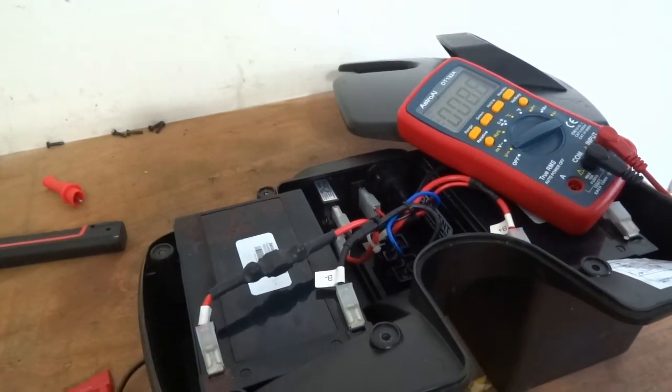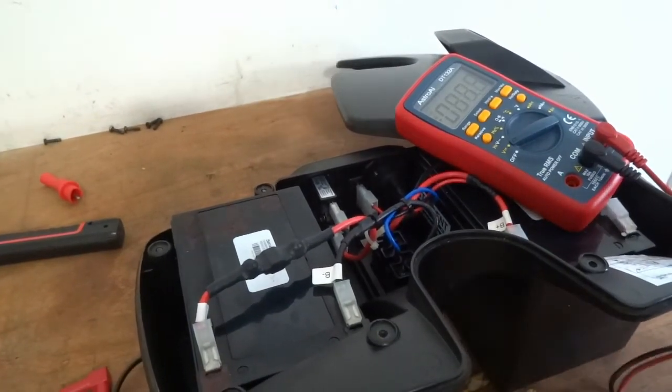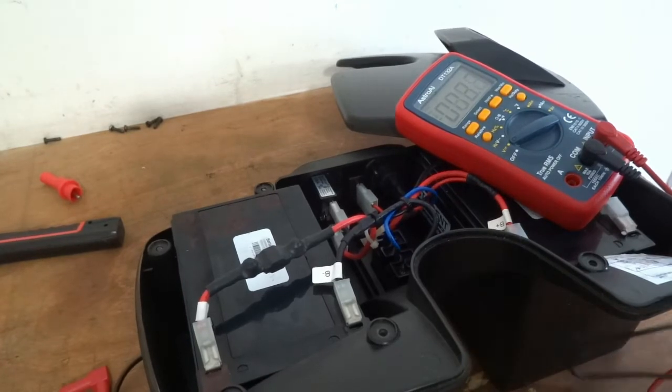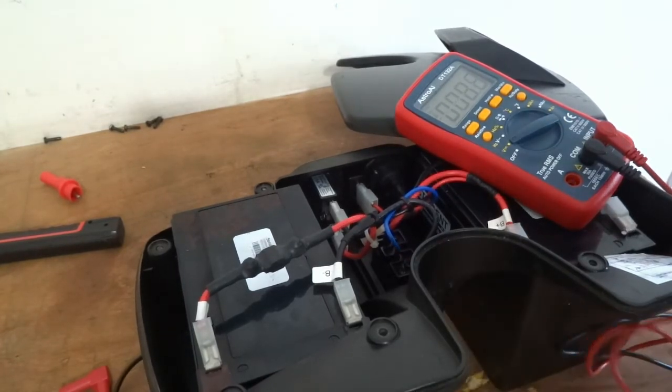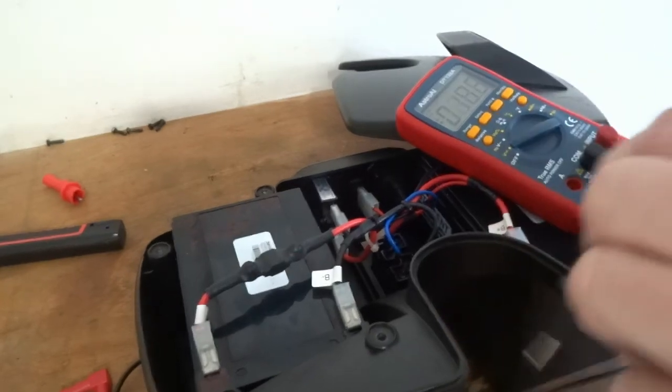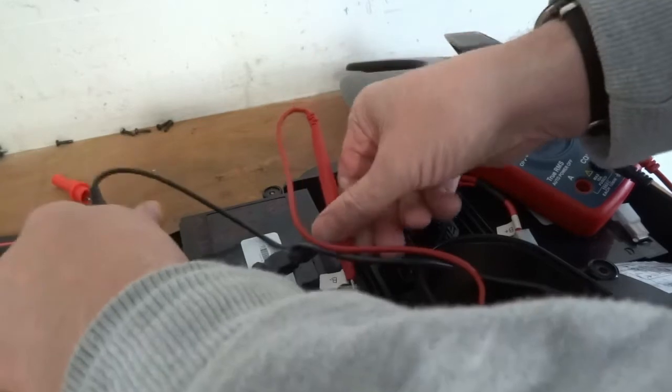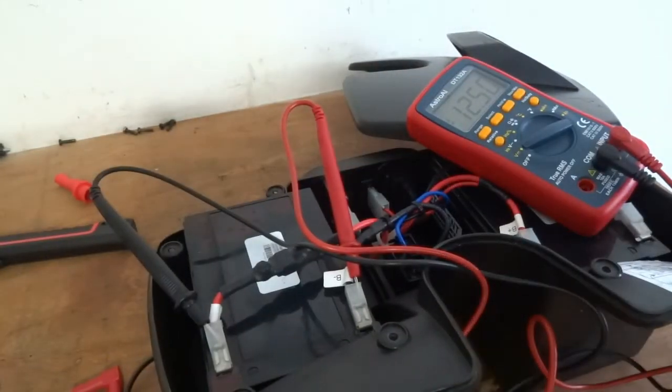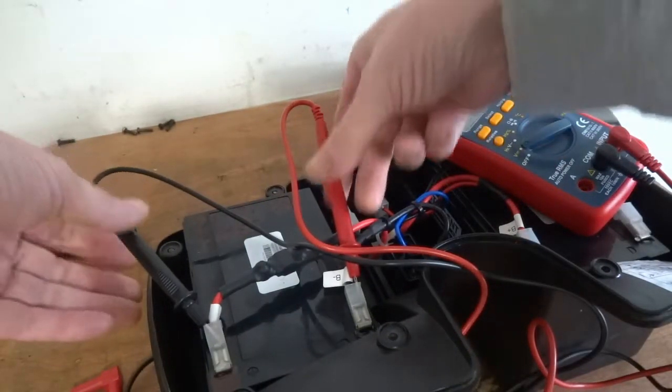Okay then, so got it set to volts DC. We'll test each battery separate first. So 12.5 volts, so about half charged.